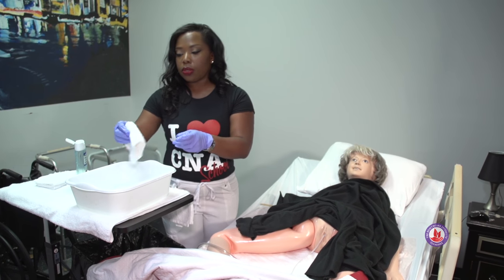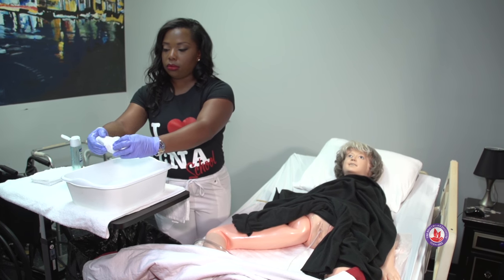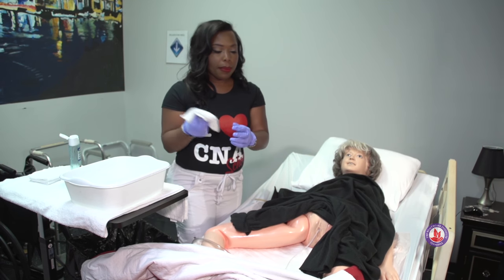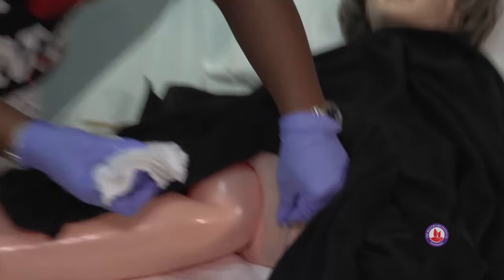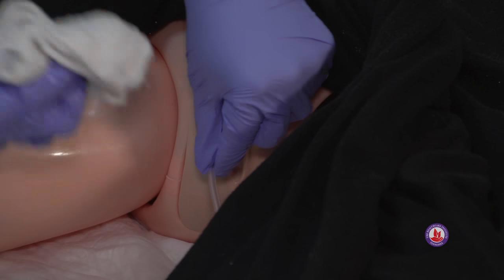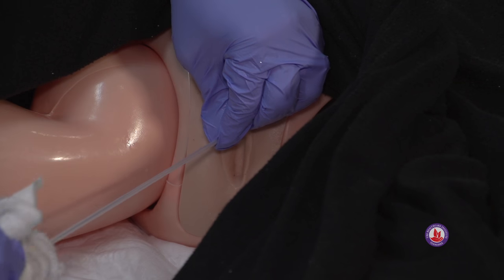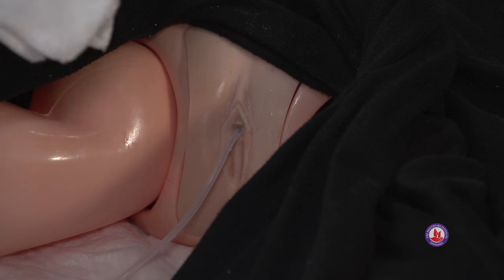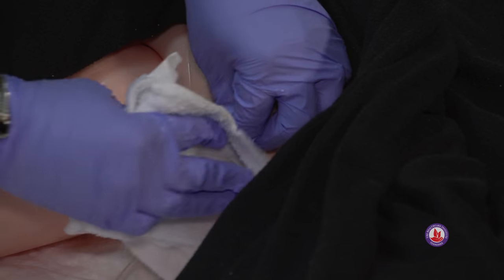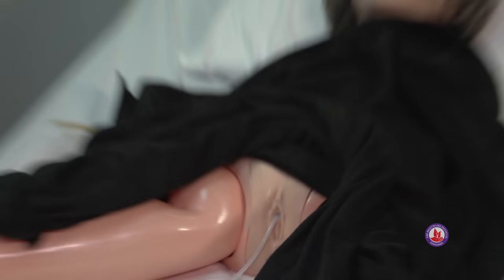The next towel has no soap, because we're going to rinse. Holding the catheter one inch away from the urethra, wipe around and down for a rinse. Pull that flap back and clean three to four inches away. Repeat with each remaining leaf, cleaning three to four inches away each time. Discard this into the linen basket.